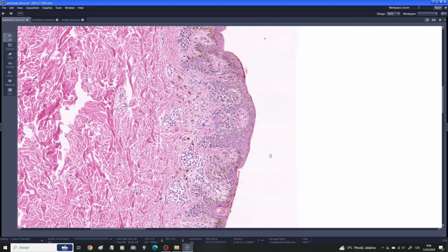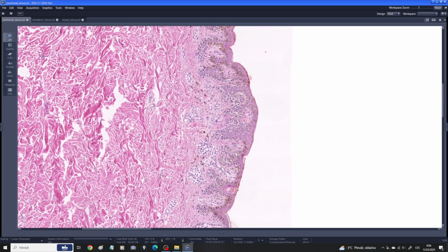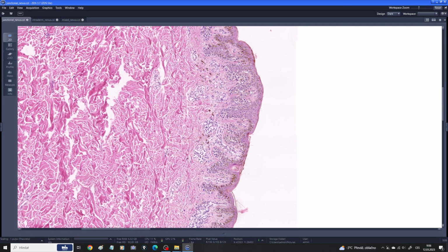And last but not least, you won't see it here, but we will see it in bigger nevi, especially in intradermal nevi, because when you look at the deeper portions of the nevus, the melanocytes will look slightly different compared to the melanocytes in the superficial portion of the nevus. We will discuss it in greater detail in a minute, so now just a brief introduction.